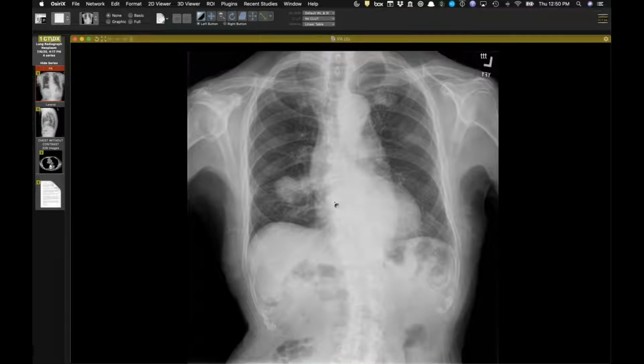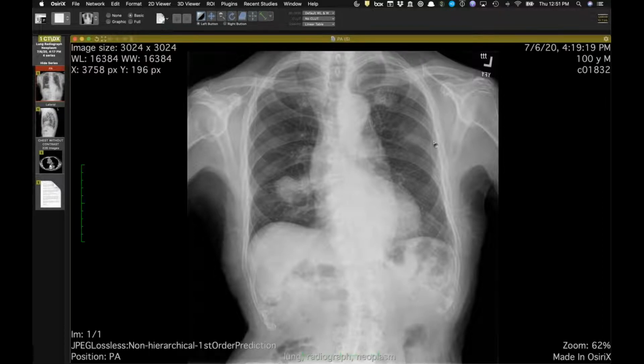Now this one is a recent radiograph, and this was a very good pickup by one of my colleagues. And David, I don't know, when you were here, Peter Callan was probably here. I don't know if you worked with him at all since he was in the ultrasound section, but he always is famous for saying that the hardest finding to make, well, he would say on ultrasound, but really on any imaging study, is the second finding and the satisfaction of search. And so this is a patient who came into the VA, and he is 100 years old. He's got a rib lesion on the other side. Yep, and that's it, right?